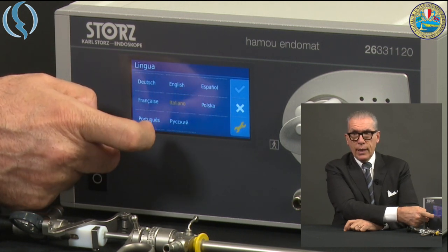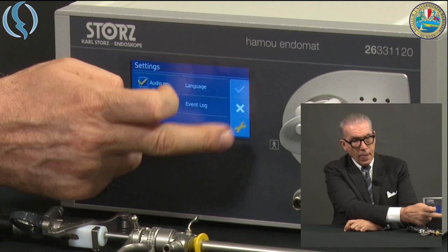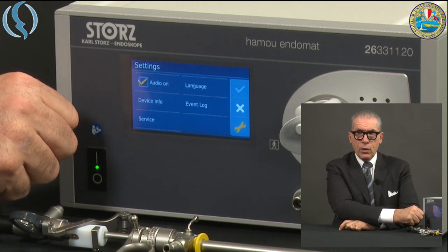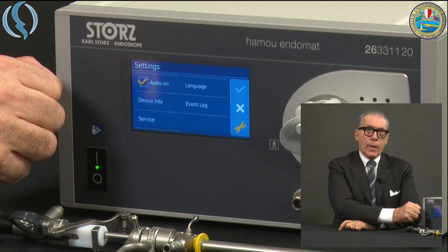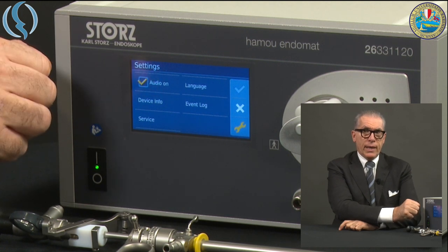Among the available settings, we can select the audio and the language — in this case we will use the English language. There are also three parameters that are not frequently used: the info, which is helpful to understand which software version is installed, the event log, and the service menu, which is necessary to understand if the pump has a problem.